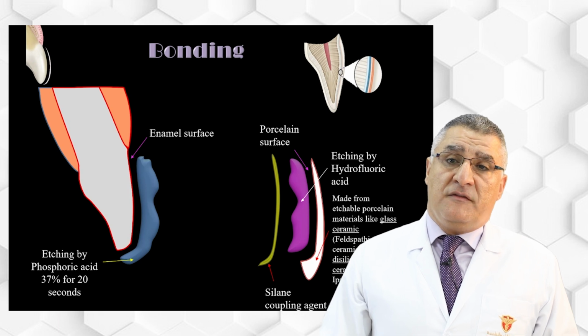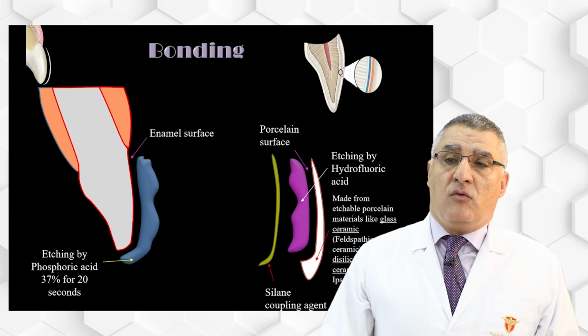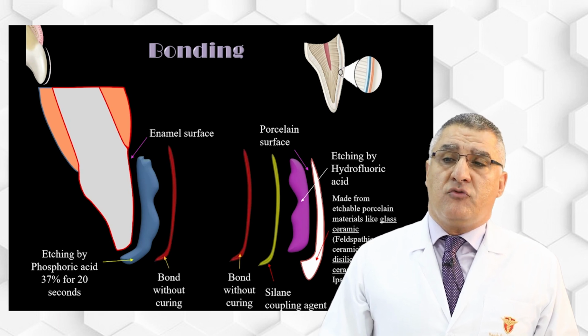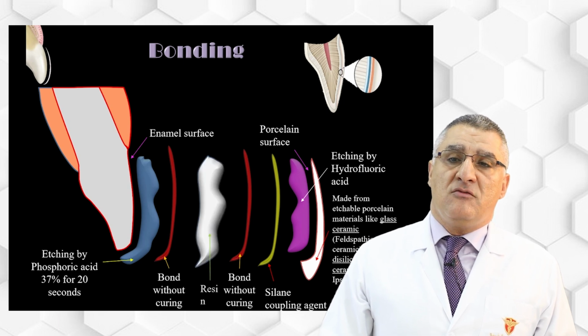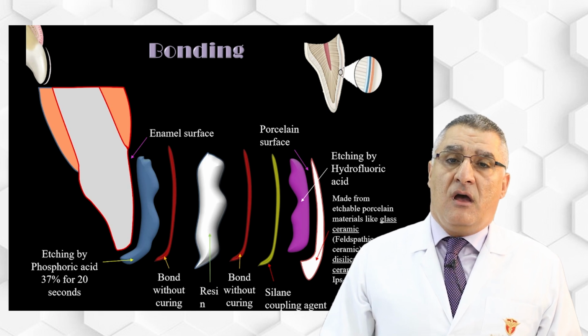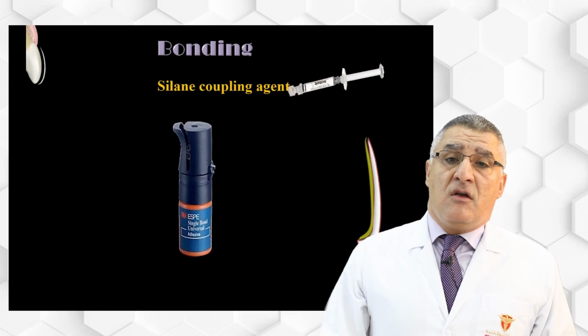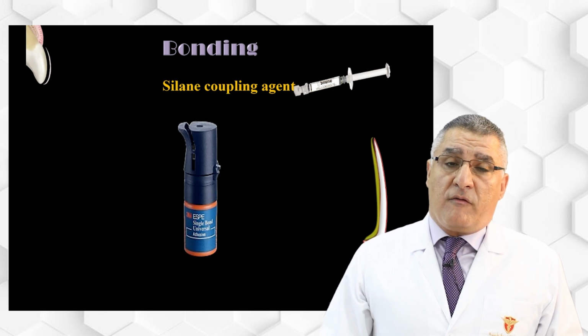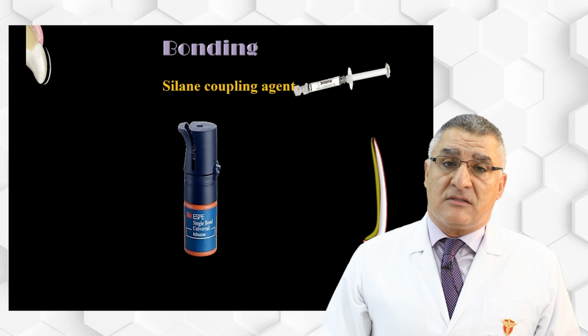In the tooth surface, we will have micromechanical bonding, depending on etching with phosphoric acid and using a bonding agent. So for the ceramic, we put etching, then silane coupling agent. Then we have to do bonding to both the ceramic, with a bonding agent for the ceramic and for the tooth, and the resin will be used in between. So these are the different layers that will be applied during bonding of the veneer.